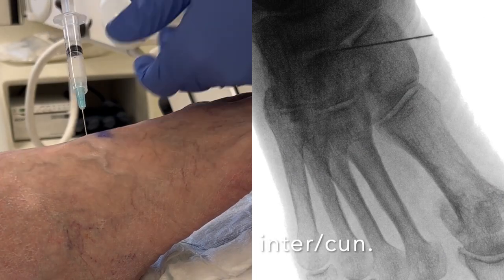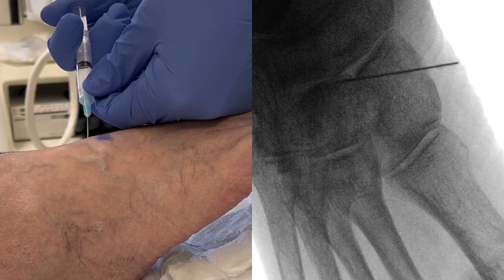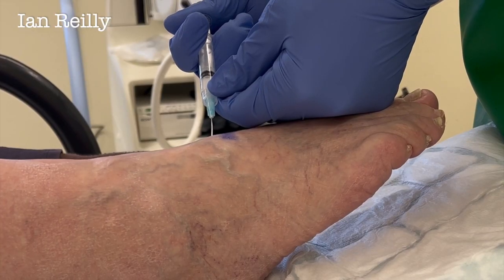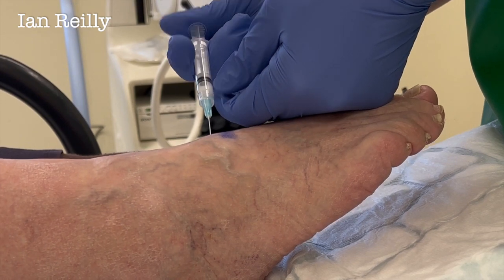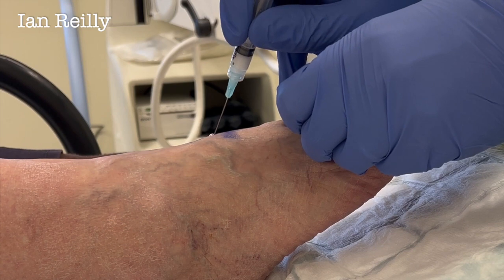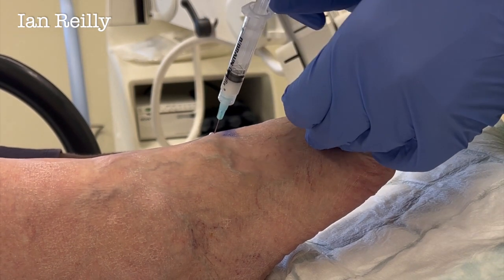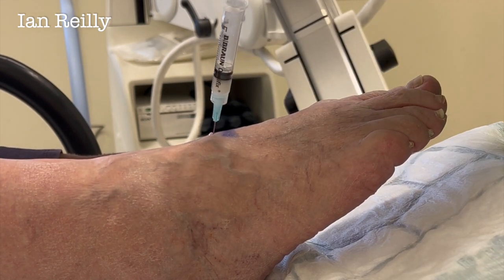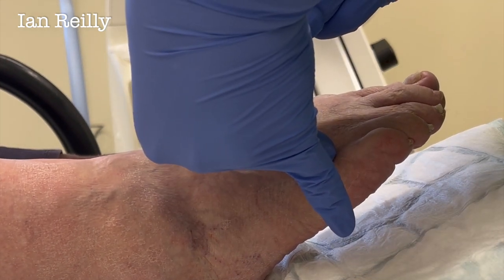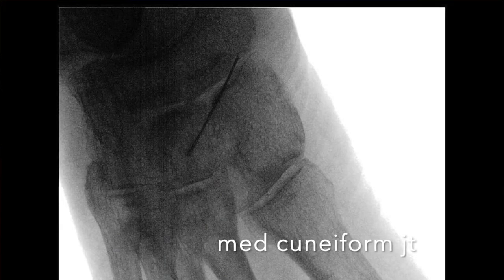You're loving that! Okay, just pop a bit in — you might feel a wee sting as that goes in. Oh, that really went into the joint there! How's that? She's fine — she says 'thank you' through gritted teeth. She's laughing at me! Oh, that went really nicely. Right, so we're going to just take that out.